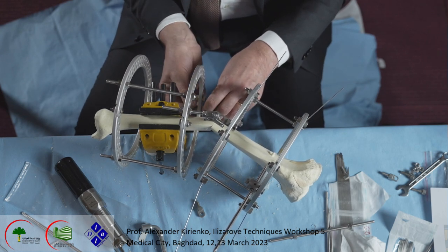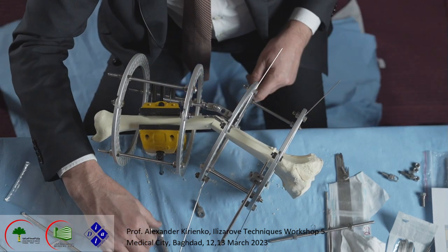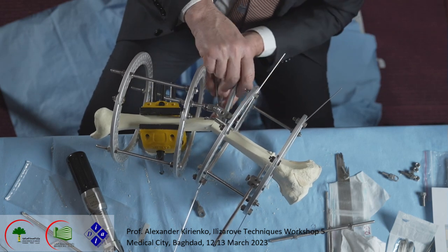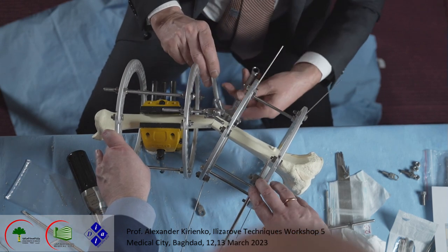And now our frame, as we start building, should repeat exactly the form of the tibia, the shape of the tibia and the alignment of the tibia.